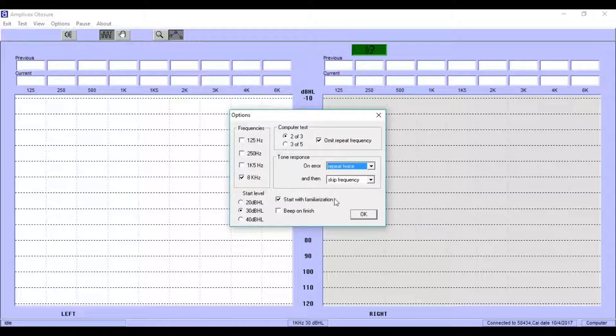Last but not least, we select Beep Finish just to inform the user acoustically when the test is finished.